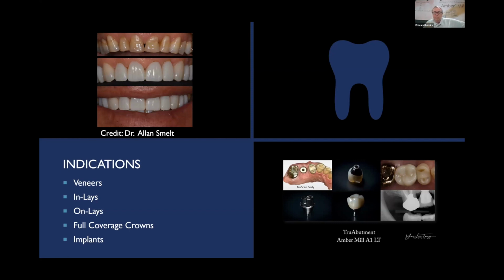For something like this, you wouldn't even consider doing an HT. You're going to get too low of a value, even though it would be an HT, simply because you're going to get that show through. So you know right out of the gate that you need to do an LT on a situation like that.